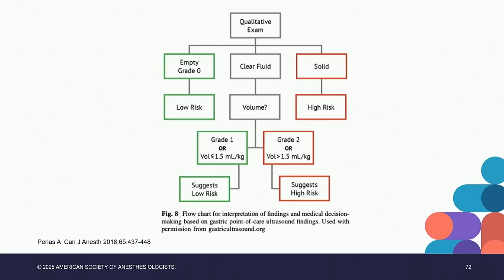This is also a very simple qualitative exam. If you have empty, that means grade 0, low risk. If you have clear fluid, what is the volume? If it is grade 1, less than 1.5, that means low risk. If it is higher than 1.5, that means higher risk. If you have solid or thick content, that's immediately high risk.